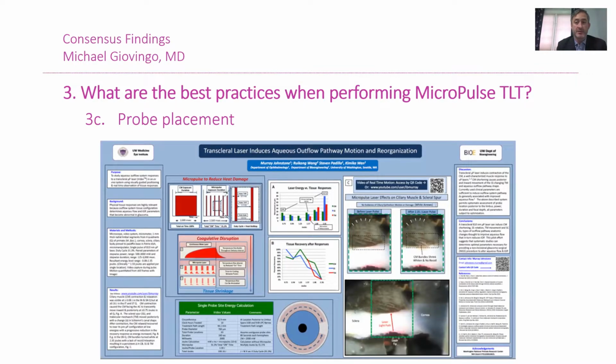Some of which may explain that are, again, I know in the past I've talked about Dr. Johnstone's work several times, but I do think it's extremely important when discussing this. It may have to do with the ciliary body destruction, but more so that it works in both positions because there is some ciliary body rotation and increasing of the outflow facility, or outflow through conventional outflow. So the placement between those two positions doesn't really matter. What I would suggest to those watching is go with what you're comfortable with. And if you are getting any issues with corneal haze or any other corneal issues, edema, et cetera, you're treating too anteriorly. Go a little bit more posterior from what you're doing.